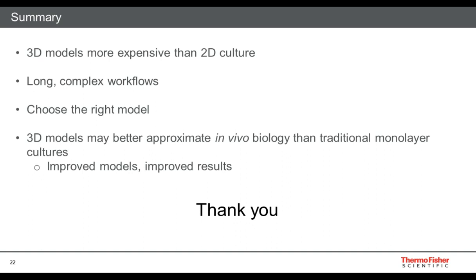Now, Mark, can you expand a little on the challenges and limitations of using Matrigel or similar technologies? Sure. So as I mentioned during the talk, a number of 3D cell models require the use of an extracellular matrix mimetic. And a lot of these methods were built using a basement membrane extract called Matrigel. And there are other similar technologies that exist out there. Geltrex and Cultrex are some of the other ones that are useful in making these organoid models in particular, but also some spheroid models.